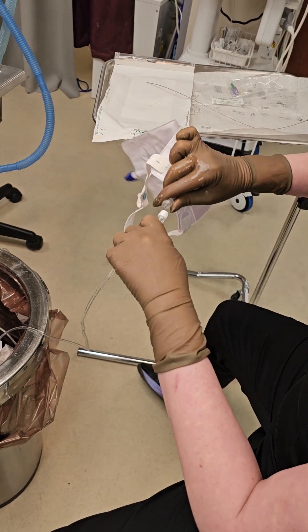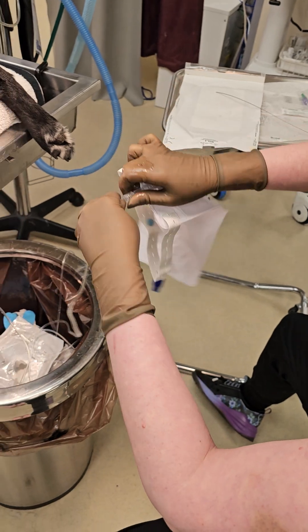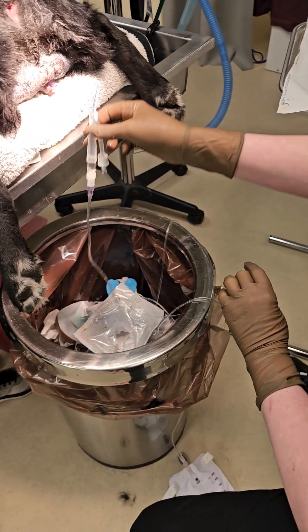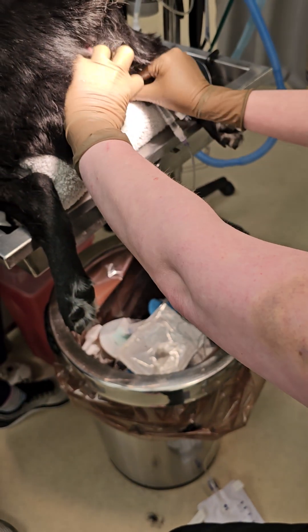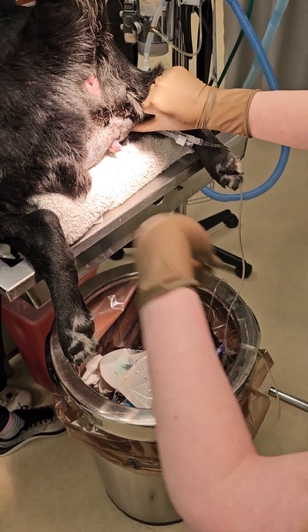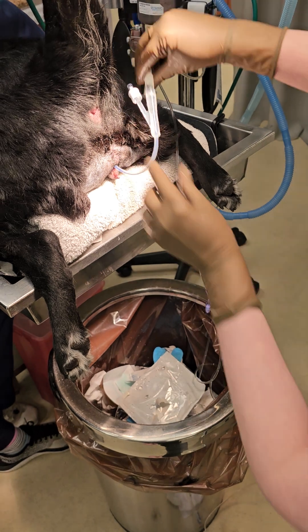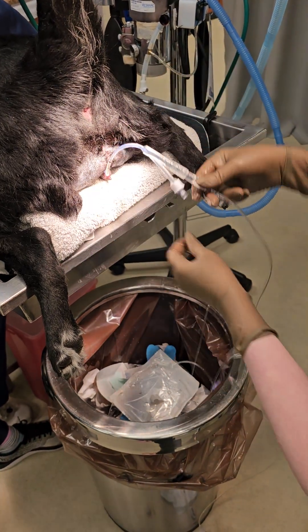The last thing I'll do is tape this either to her belly, the inside of her thigh, or somewhere to decrease tension. A lot of times you can just tape it right here. Sometimes I'll also use stockinette mesh and keep it right there on her ventral abdomen, just so it doesn't have a lot of tension on it.